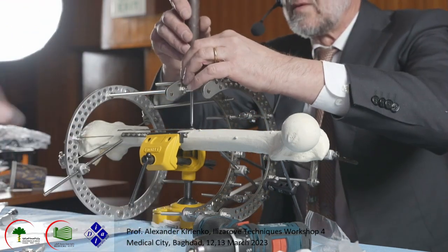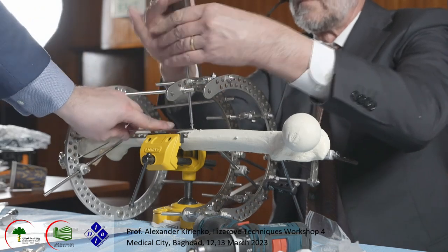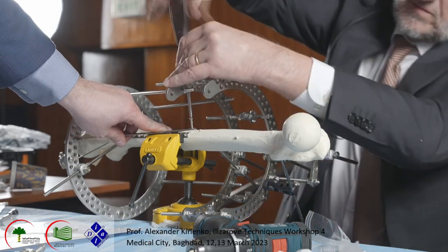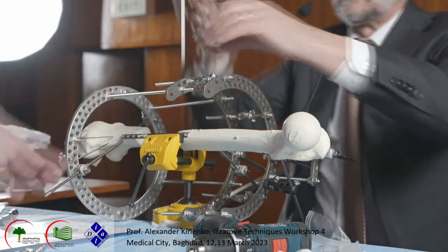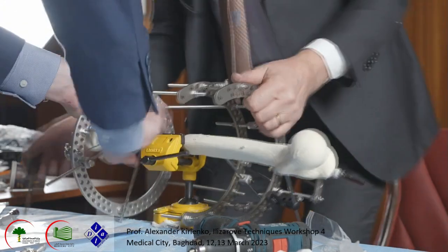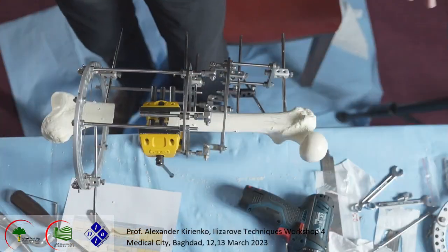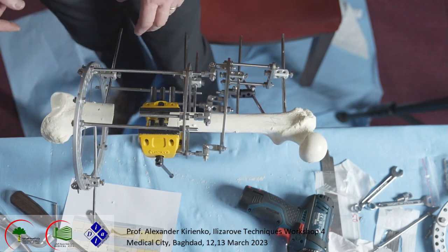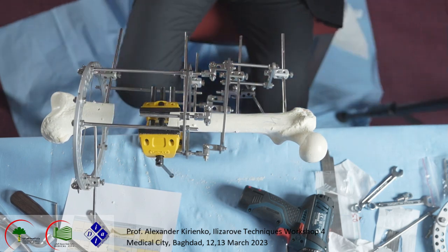Okay, this is cortex screw. This is metaphyseal screw. Okay. Plate is attached, disattached. Okay. Nice. Now we have a defect. We should connect later. Maybe we connect with this rod, but it should be the posterior one. And we proceed with the surgery.